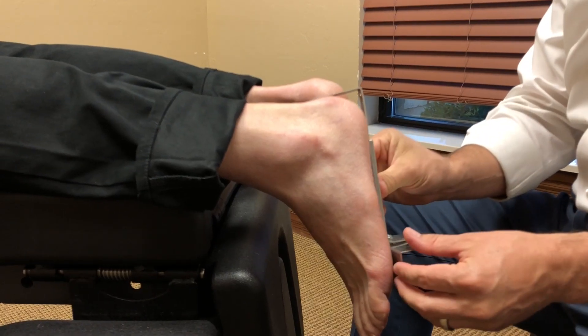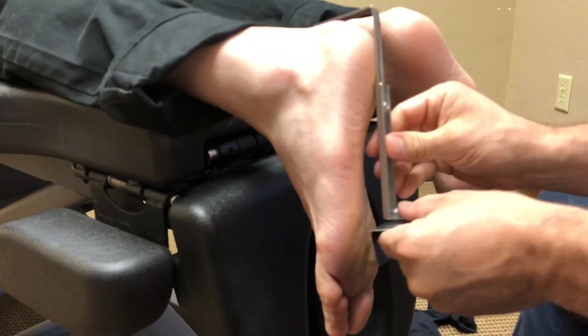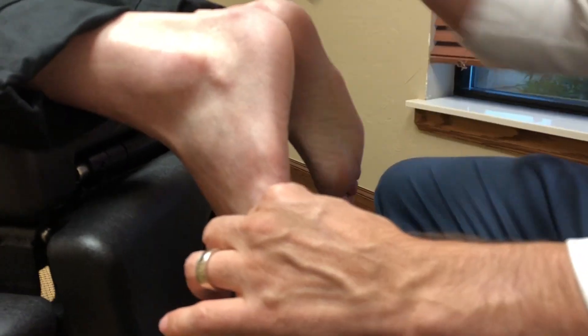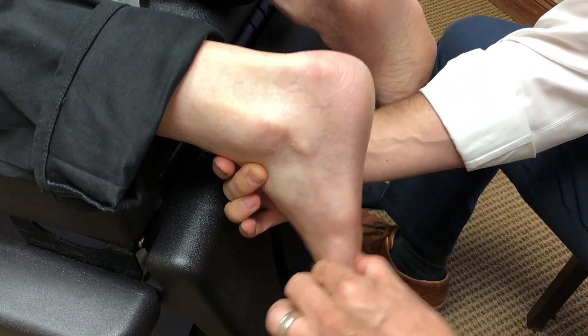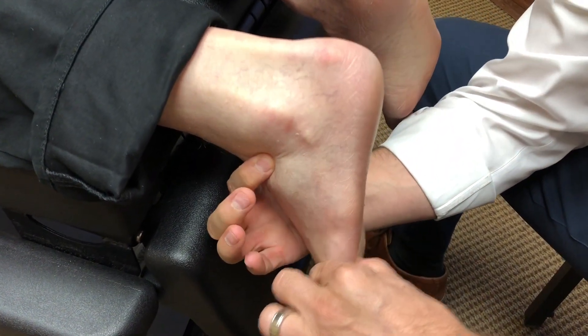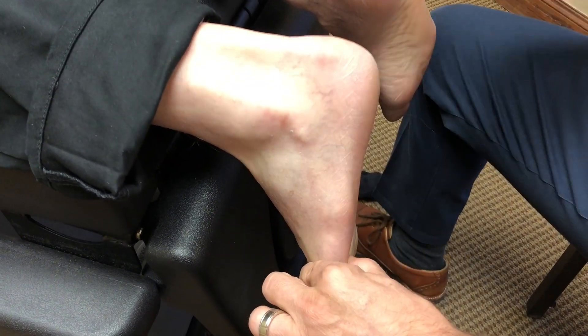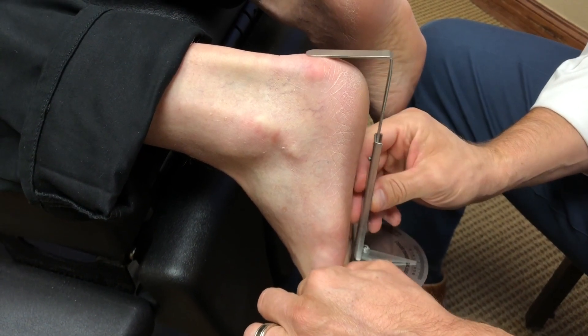We're going to extend that until that bar length reaches the fifth met head. Then I can put my thumb on the fifth met head to stabilize the foot. As I'm checking for subtalar neutral, I have a place to put my thumb. I'm going to find subtalar neutral, which is here, and I'm going to lock the forefoot onto the midfoot. Then I'm going to place my forefoot measuring device on there.